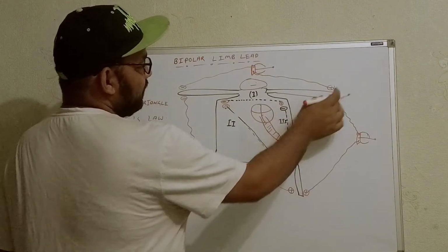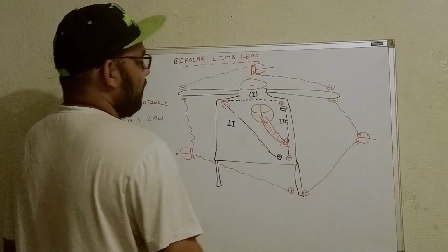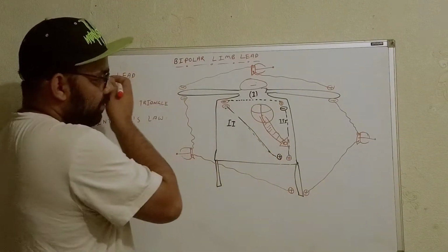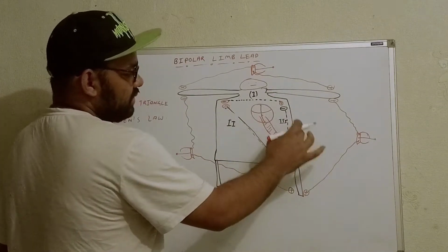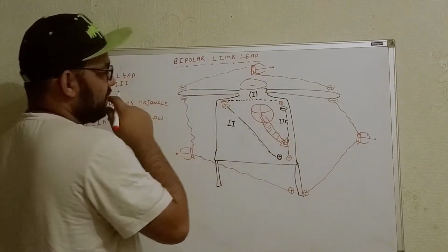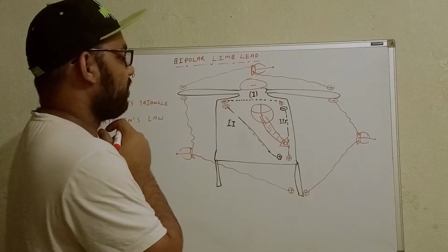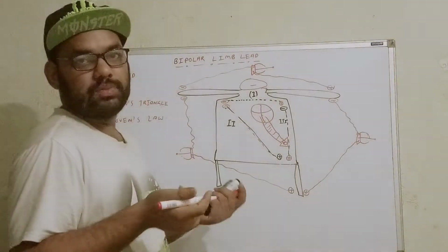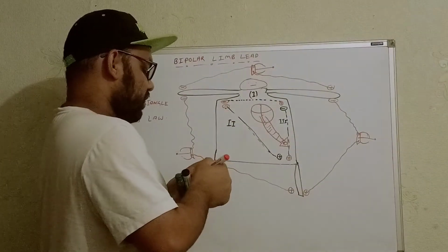So you can see in terms of the lead number 1, this side will be more positive. And what about the right, the upward and the right side, because the vector is going left and down. So in the same way, it's the positive side. In the same way, you can say that in these positions, the value for the potential will be negative, or it will be less in comparison to the body's potential. Okay, that will be the average potential with respect to the potential of our body.